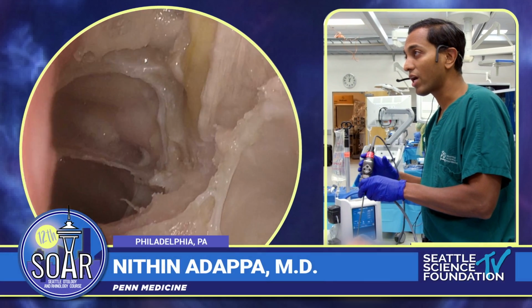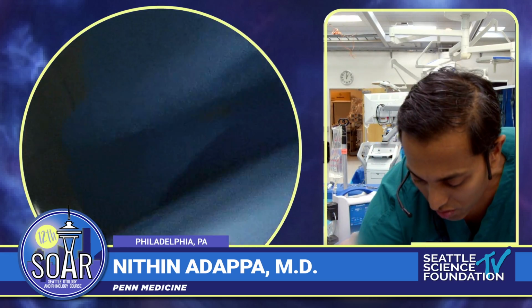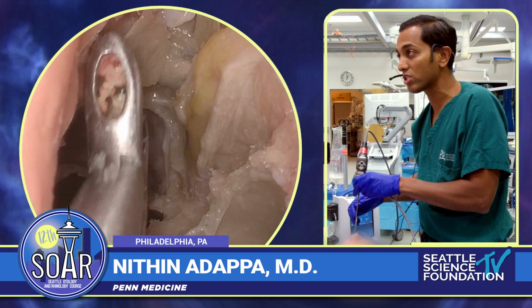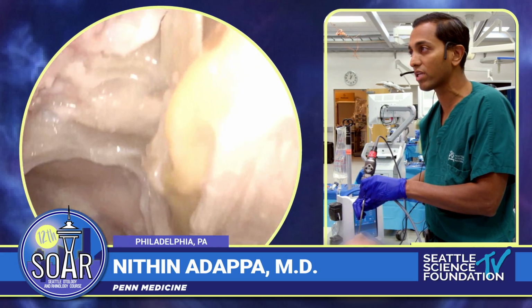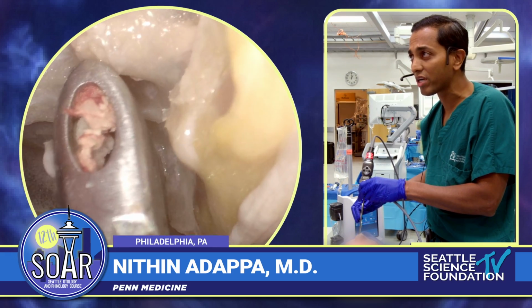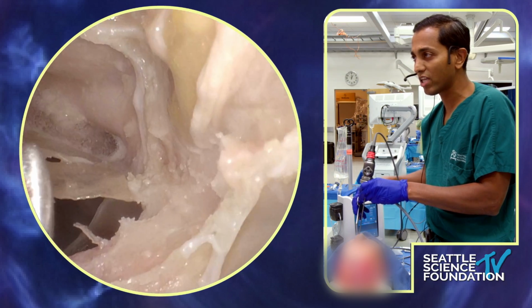Beautiful. So I actually was not planning to operate anymore or do any more demo dissections, but then I saw Dr. Sindwani was in here, and he got a hole in the cribriform, in the ethmoid here. So I'm going to close the CSF leak that Sindwani created here. But otherwise, yeah, I'm kind of ad-libbing right now.